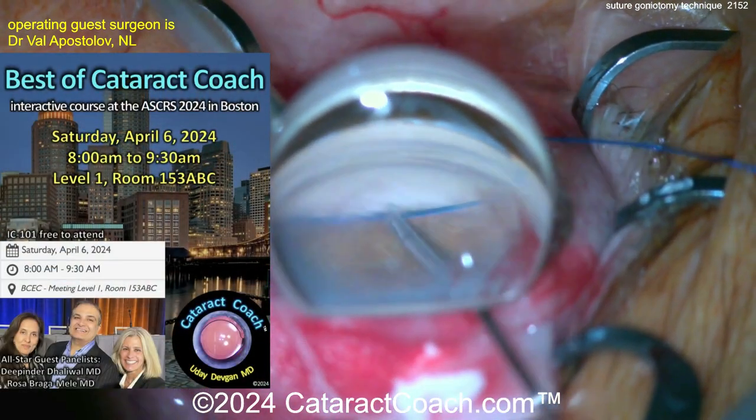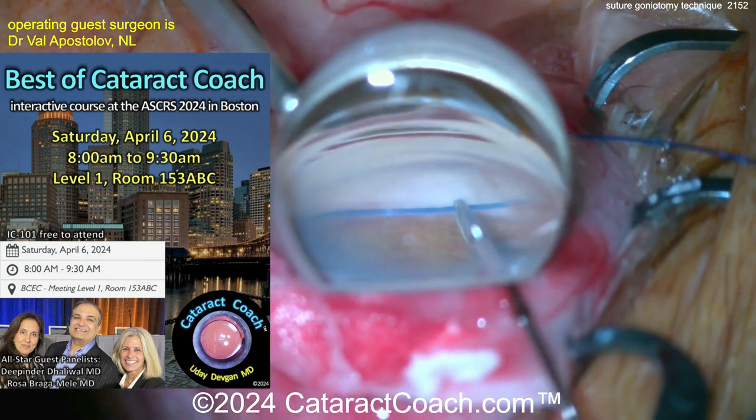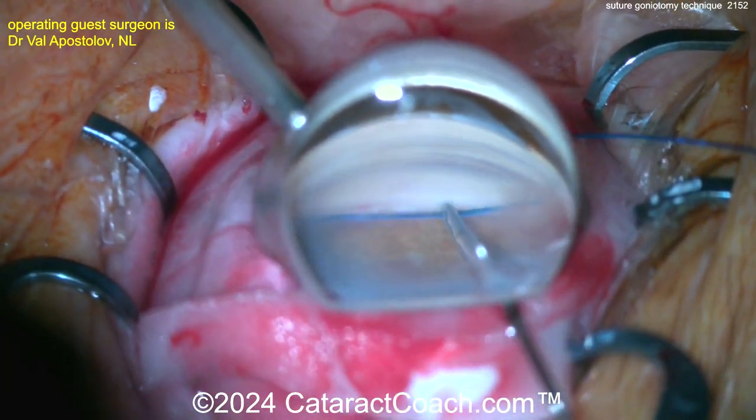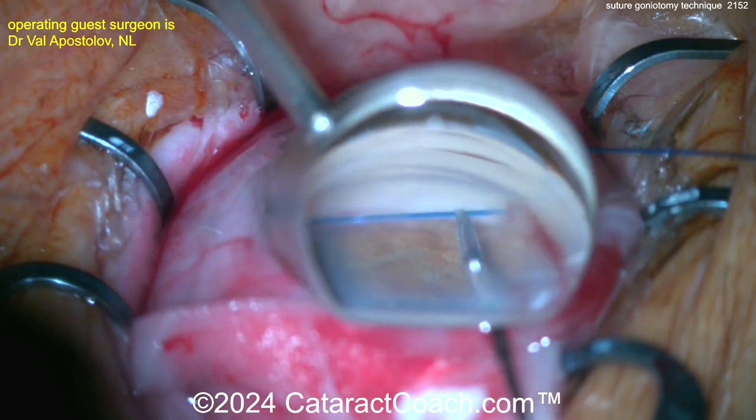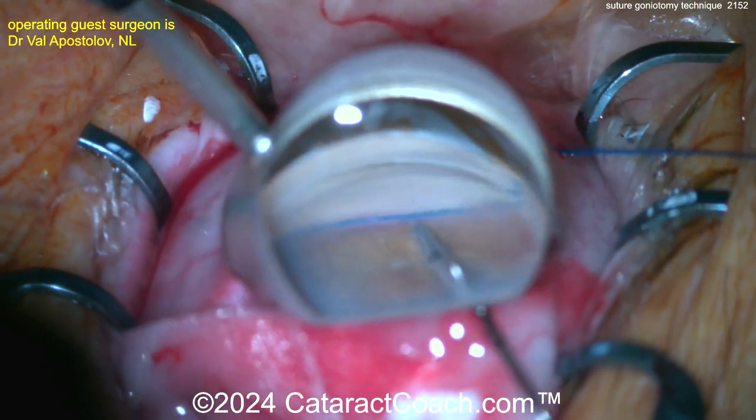Remember, we're going to have great cases like this at our Best of Cataract Coach course coming up Saturday, April 6th at the ASCRS in Boston. Still advancing it, and as this goes around you should be able to go the full 360 degrees.